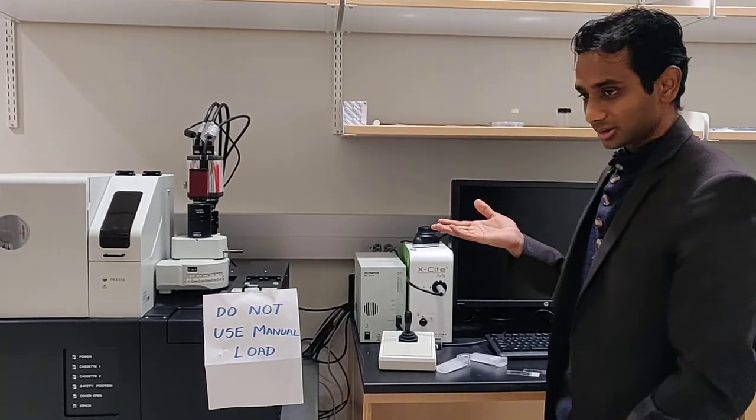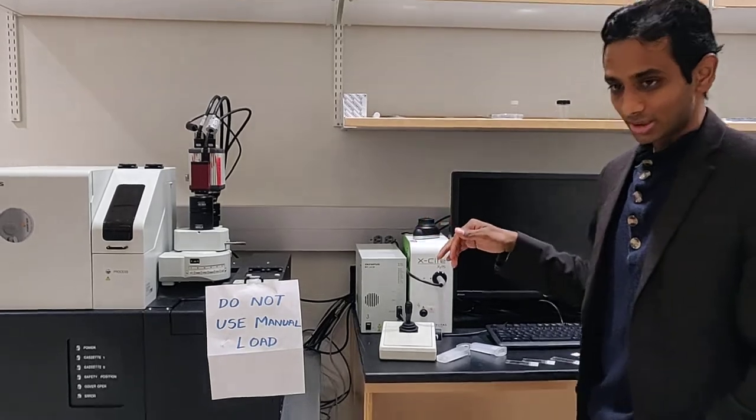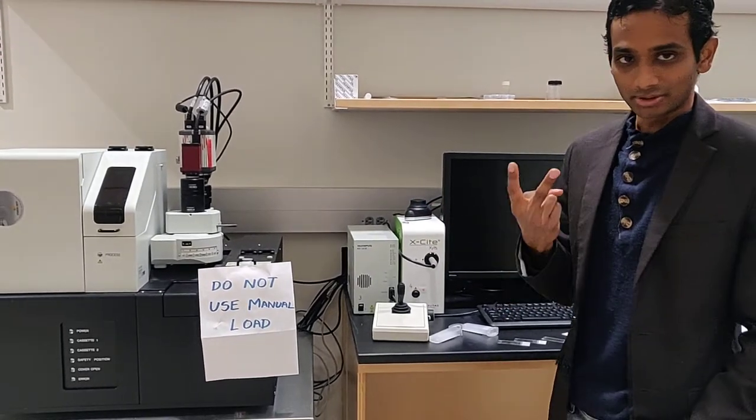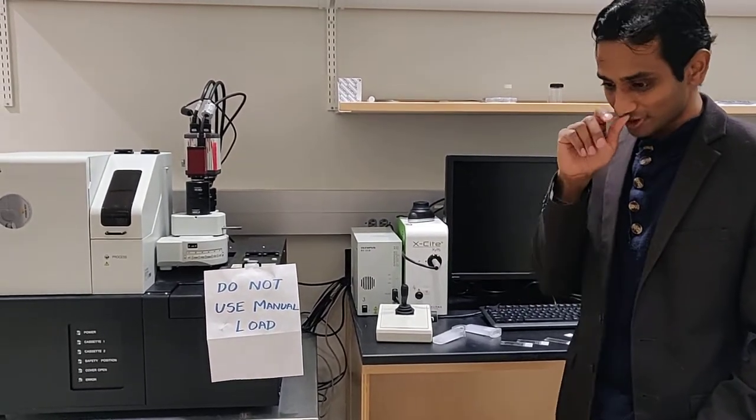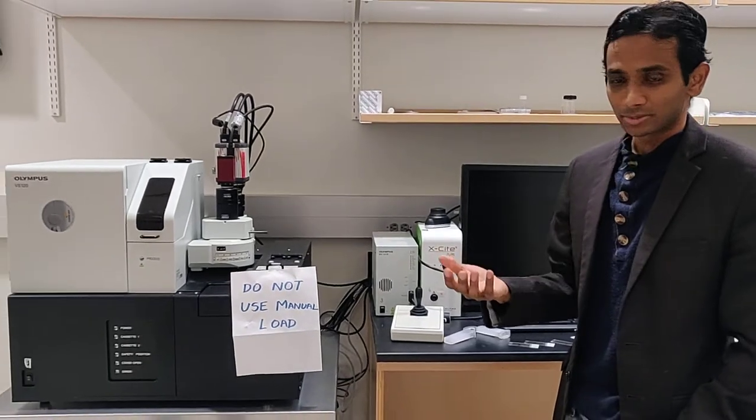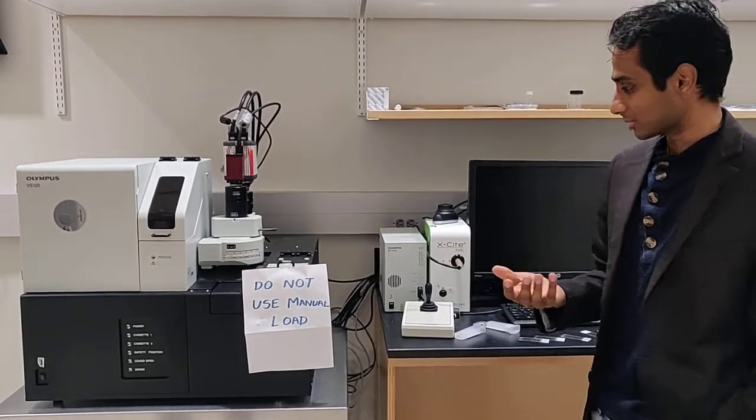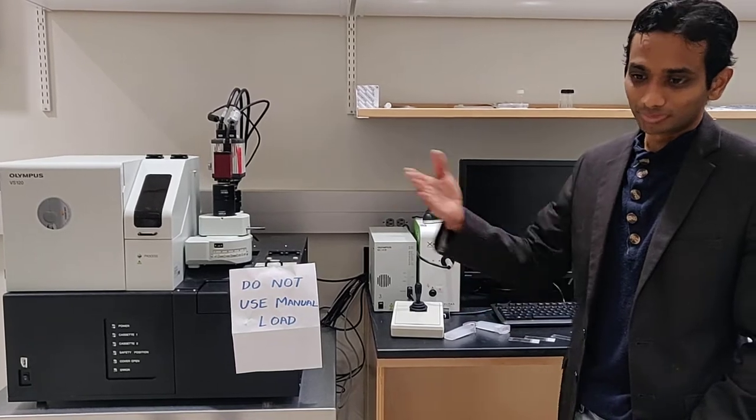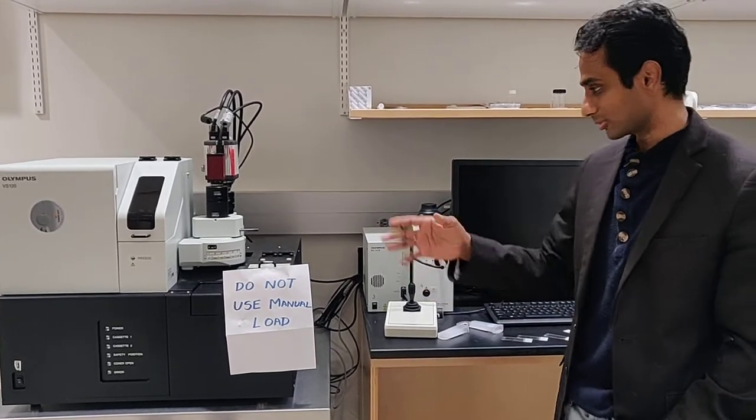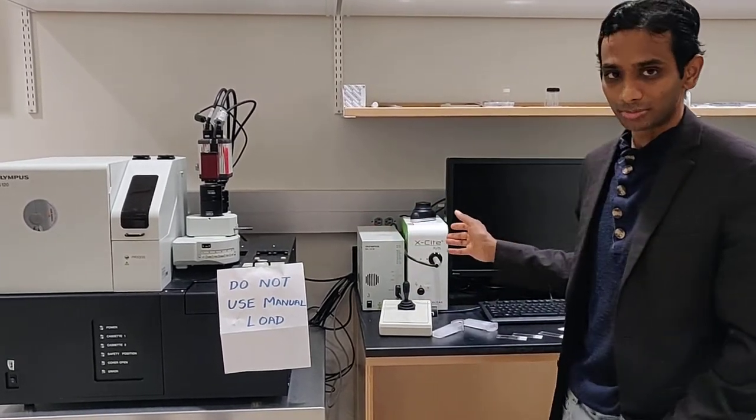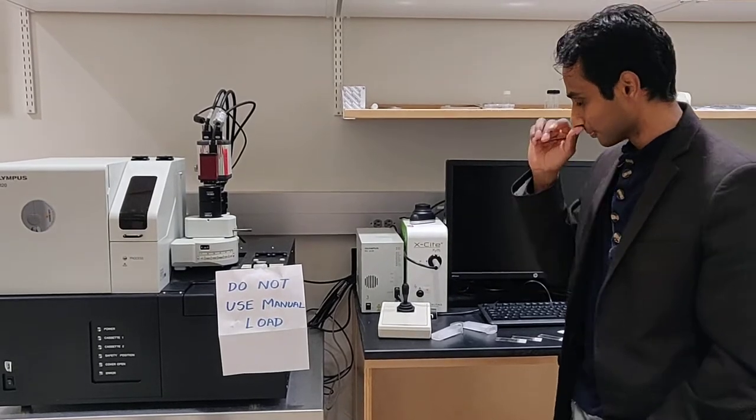Before we get here, I let people watch two video modules. First module is mainly focused upon bright field imaging. Second one is focused upon fluorescence imaging. But watching both of them helps them get an idea of the overall big picture of how to use the microscope.